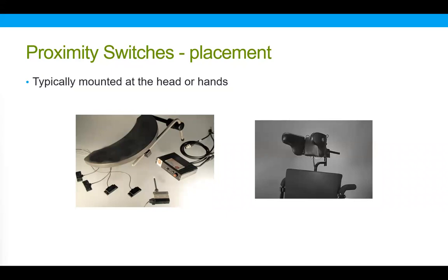So if you're using more than one of these switches, they do require a larger travel distance than fiber optics, which we'll look at here in a moment. To the right here is the head array. We have a lot of different head arrays on the market. The head array is a tri-pad headrest. There's 3 pads. And when you touch your head to the back pad, the chair moves forward. Touch your head to either side, and you turn the chair in that direction. The head array is a very common alternative driving method, and it uses proximity switches that are embedded within the pads. Now, as this is a capacitive switch, it's important to keep in mind a few limitations.